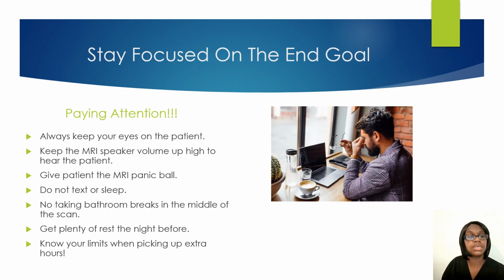So to stay focused, you want to make sure that you are always paying attention. Keep your eyes and your ears on the patient. Keep the MRI speaker up high so that you can hear the patient. Give the patient the MRI panic ball. Do not text or do not sleep. Do not take bathroom breaks in the middle of the scan. Go before you start the patient or go after you end the patient exam. Get plenty of rest the night before so that you do not feel tired and burnt out. Know your limits whenever you are picking up extra hours.